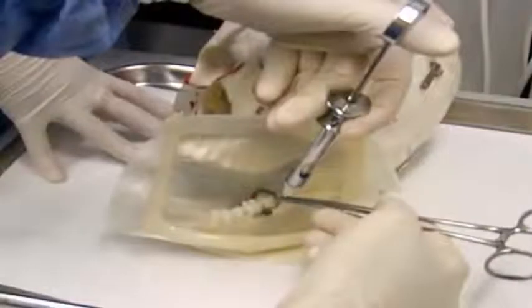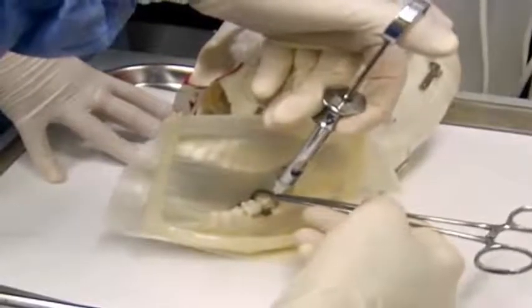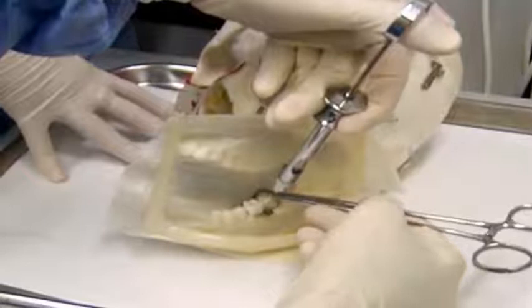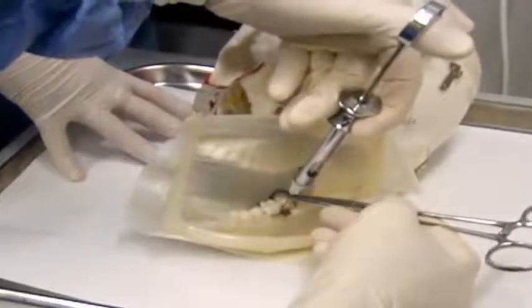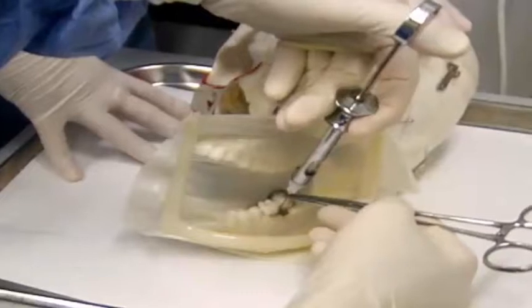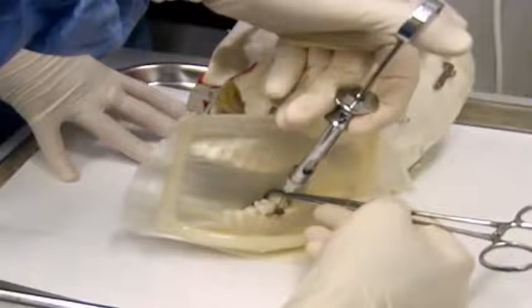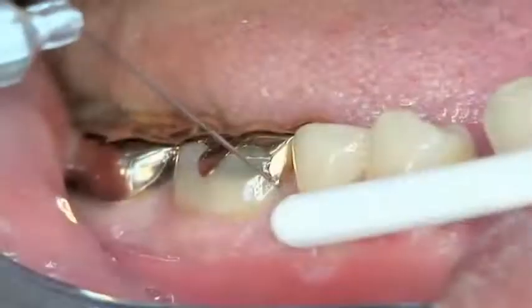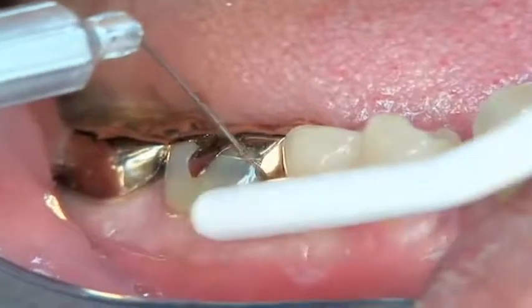A hemostat is a very useful adjunct to help support and direct the needle. This shows how the needle is positioned into the interproximal space. It is supported and aligned with the thumb and forefinger, which gives support to the needle. In a patient, the thumb and forefinger are supporting and directing the needle.